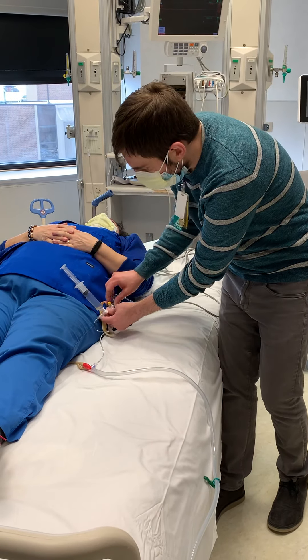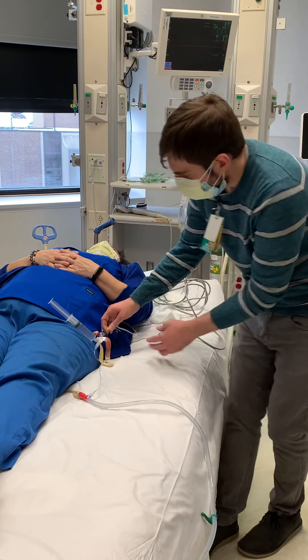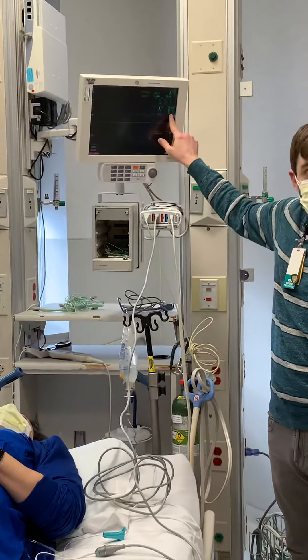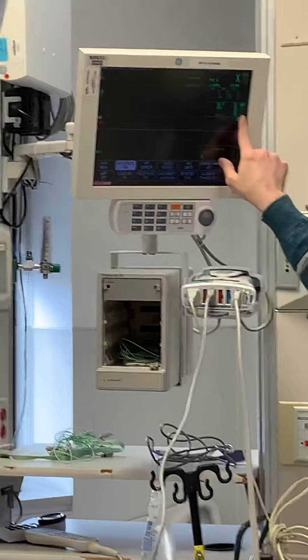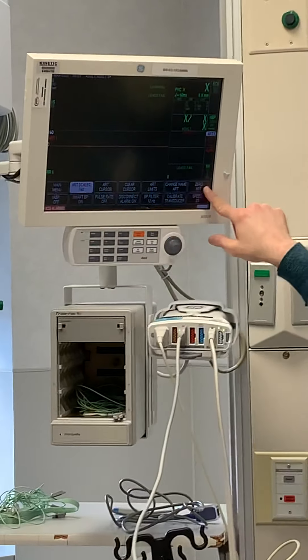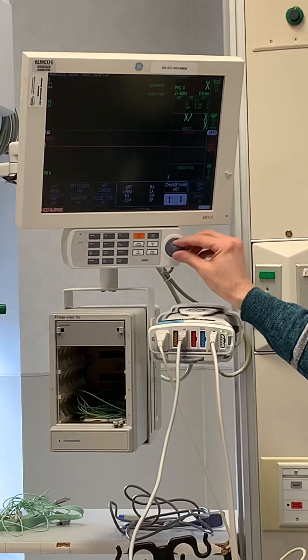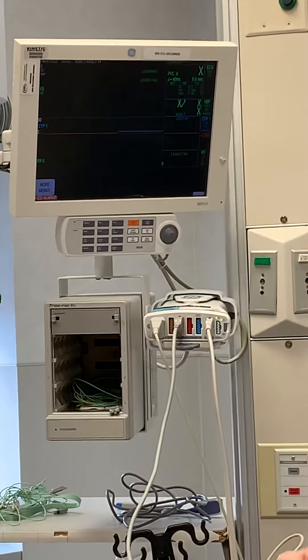It's right around the hip. Open up your transducer to air. This is defaulting to an A-line — we don't want it as an A-line, we want to look at it as a CVP. So we select art, go over to change name art, and change it to CVP. It turns blue — we're good.